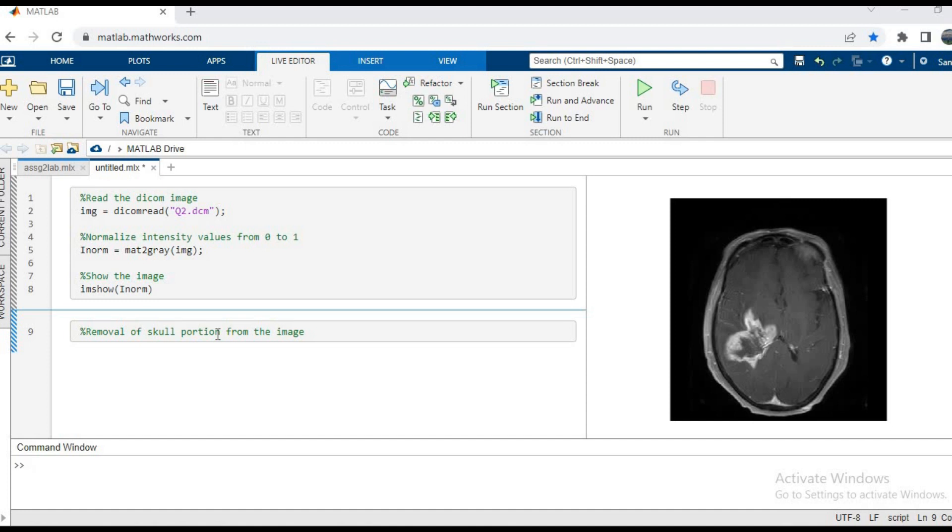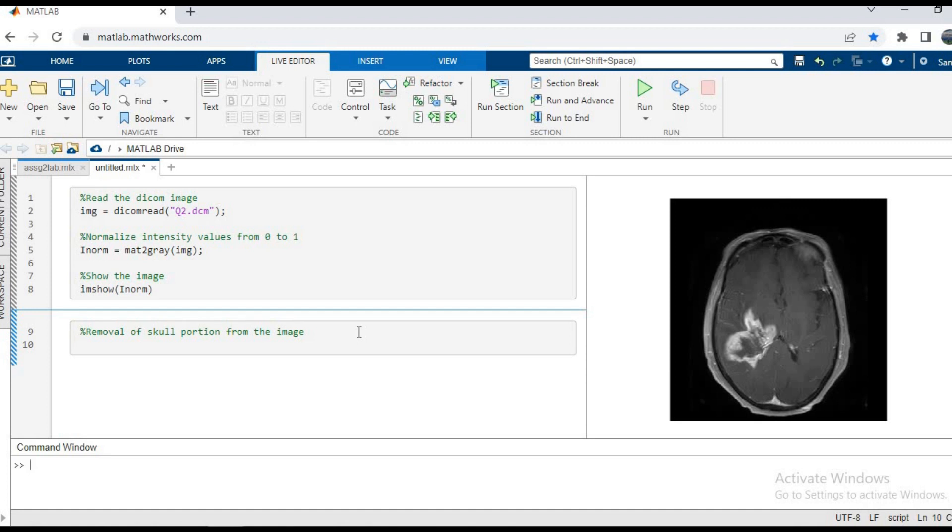Welcome back to this tutorial. In the last tutorial we saw how to read an image, normalize it, and show the image on the display screen. In this one we're going to see how to remove the skull from the image. This is an important step when dealing with cross-sectional images of the brain.